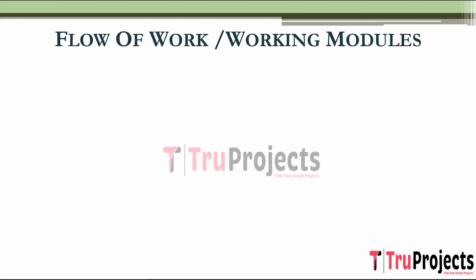To implement this project, we have designed various steps in the flow of work. Coming to the first step, which is importing the packages. In this step, necessary Python libraries are imported into the project environment. Here we have imported NumPy and Pandas for data manipulation, Seaborn and Matplotlib for visualization, sklearn for machine learning, Flask for web development, and TensorFlow for deep learning.